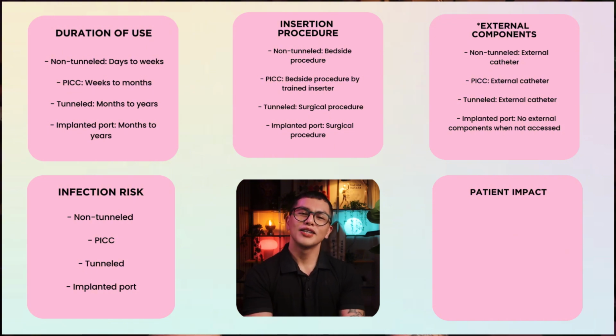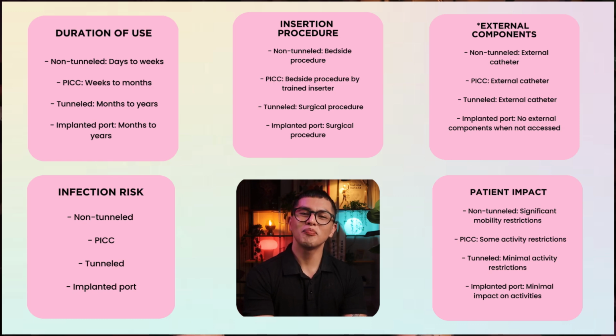Patient impact. Non-tunneled, significant mobility restrictions. For PICC, some activity restrictions. Tunneled, minimal activity restrictions. Implanted port, minimal impact on activities.